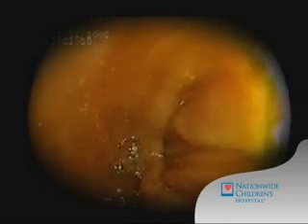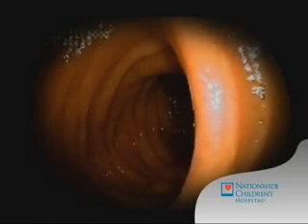As the scope is first advanced, the balloon is inflated, followed by sliding the overtube down and also into the small intestine. By alternating insufflation or inflation of the balloon of both the overtube and the scope, we're able to inch and advance the scope and the overtube down the small intestine.